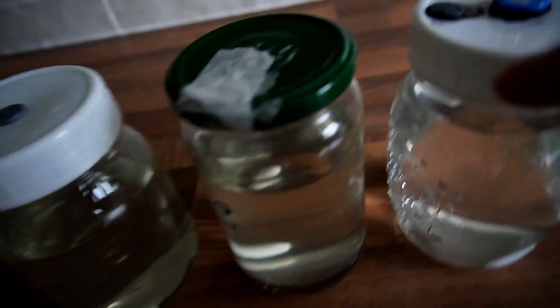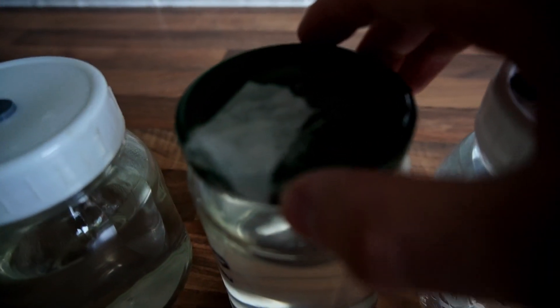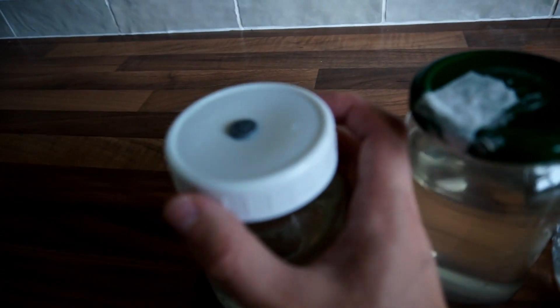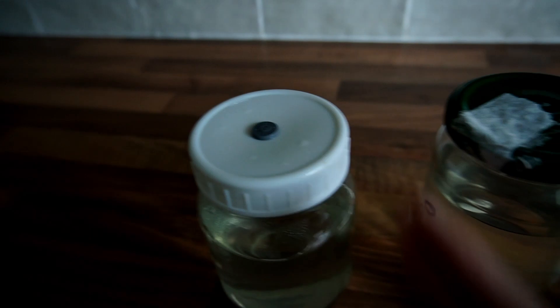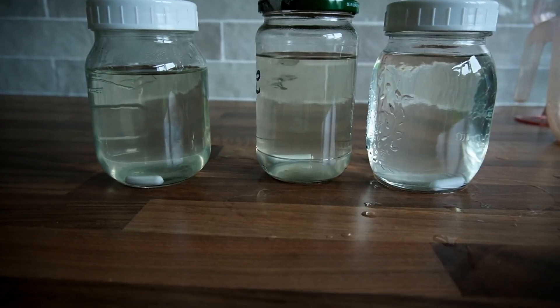This lid here just has basic micropore tape, and this lid here has a straight injection port — I've loosened it a little so the pressure can equalize in the jar when it gets sterilized. This lid has a standard gas exchange and injection port.